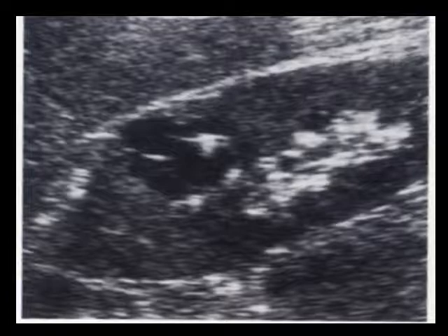Now, that is what we expect to see. That is normal in a kidney. If we don't see that, there's something going on with that relationship in the kidney. Now, I want you to look at the liver here and the greyness of the liver, and then the greyness of the cortex of the kidney. They roughly look the same grey level. And again, that is normal. We expect to see that. So what we say is that the liver is isoechoic to the cortex of the kidney. It's the same, isoechoic to the cortex of the kidney. And that is what we expect to see in a normal person.